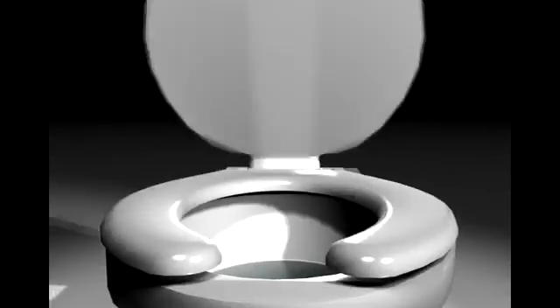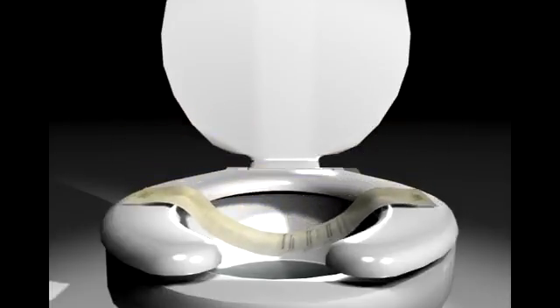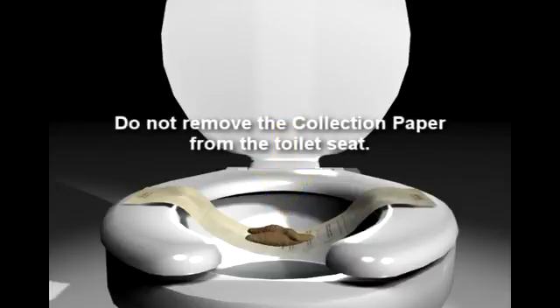Raise toilet cover. Remove tape cover from each end of the collection paper. Position collection paper on rear half of seat, allowing paper to sag. Press the tape down on each side of the seat. Deposit fecal specimen on collection paper. Do not remove the collection paper from the toilet seat.